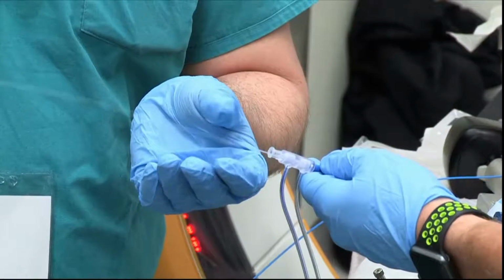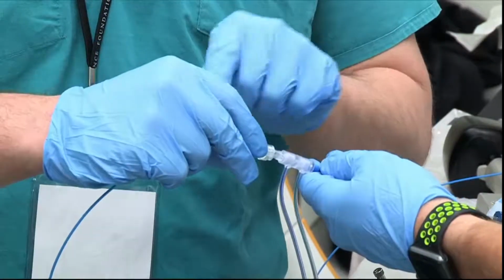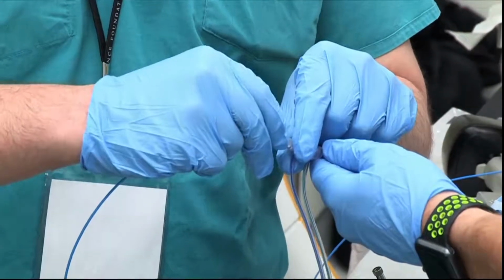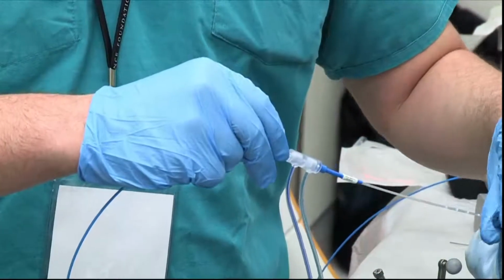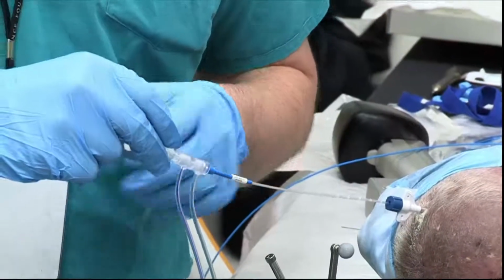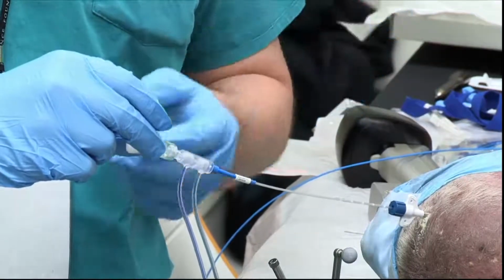This cannula is closed at the end, so you don't really need to measure anything other than where this needs to be taken back from, or when it's snug. So this has all been tightened, and you're ready to go to the MR suite. You take the patient out of pins, we go to the MR, and we'll start our ablation.